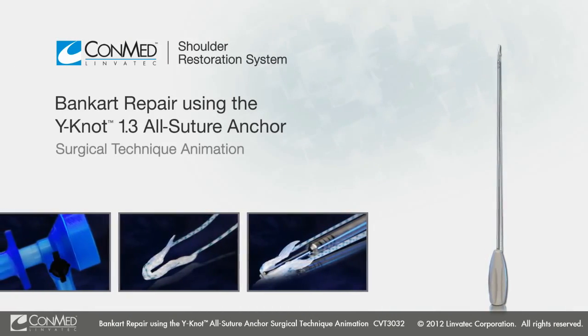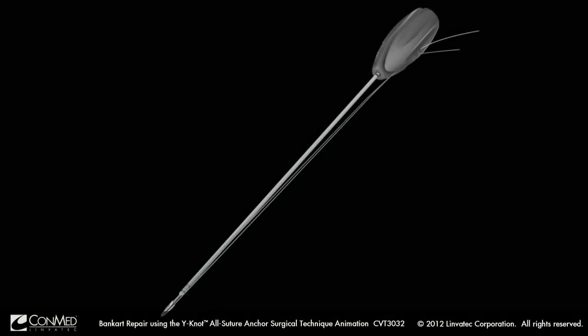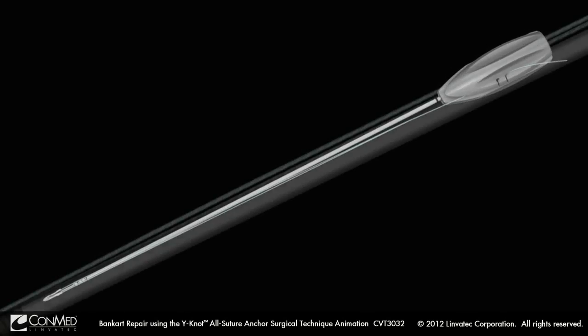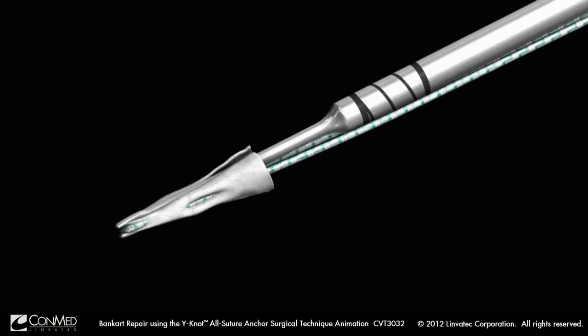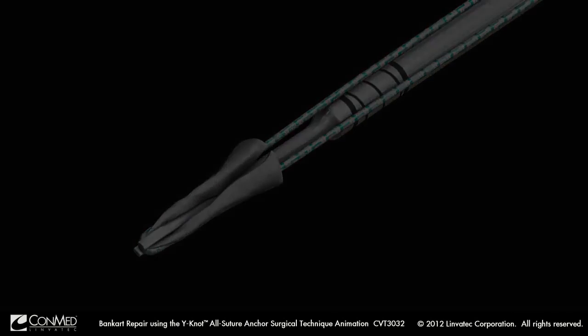Presenting a technique for anterior labral repair and stabilization utilizing the Y-Knot Anchor from ConMed Linvatec. This 1.3 millimeter all-suture anchor achieves a 360-degree fit within glenoid bone stock to provide secure fixation for intra-articular labral and capsular-based procedures.